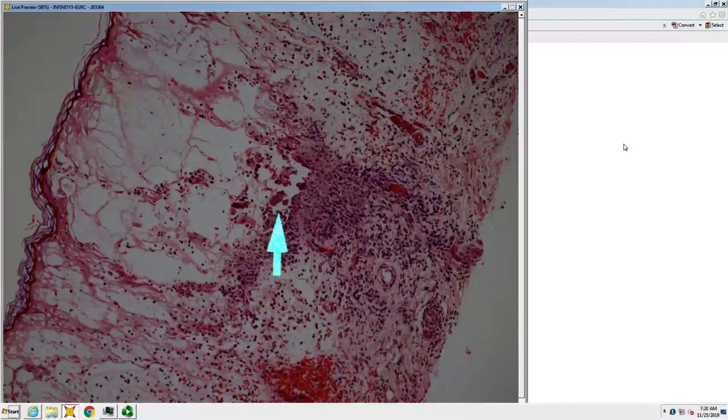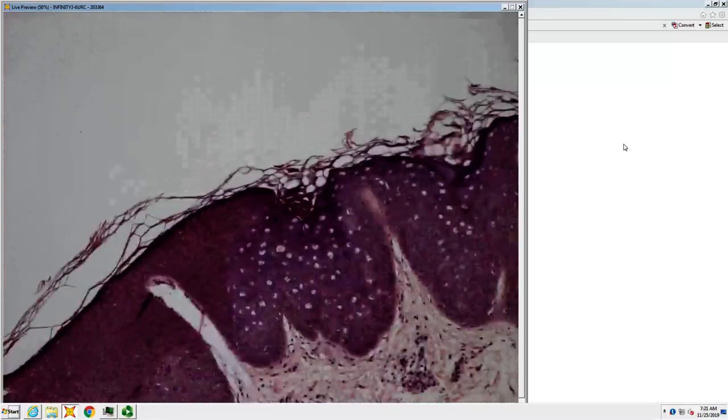There's also ballooning degeneration, and then there's clear-cut margination of chromatin and ballooning, which lead to herpetic. And clinically, it was zoster. But the reticular degeneration would suggest viral, but not necessarily herpes virus.